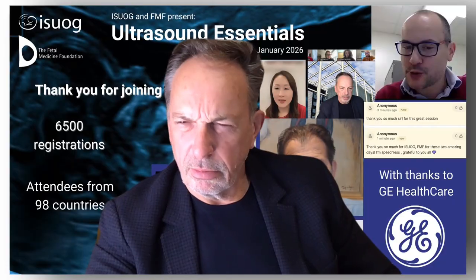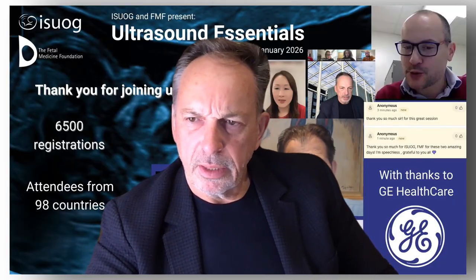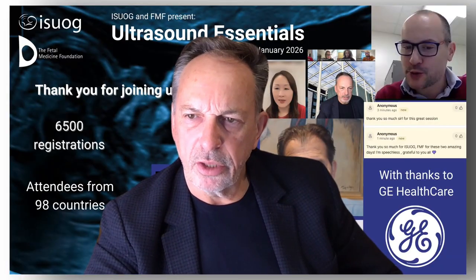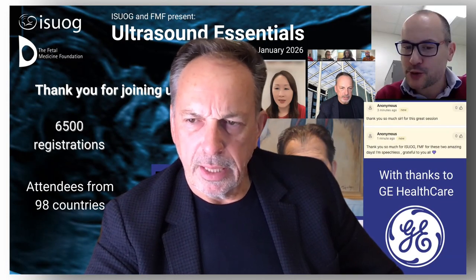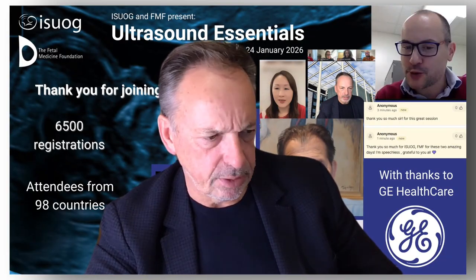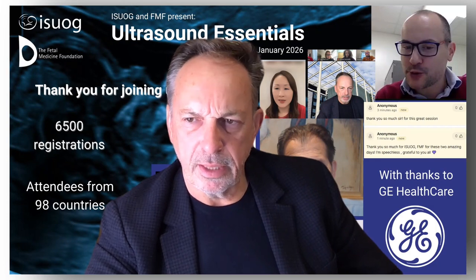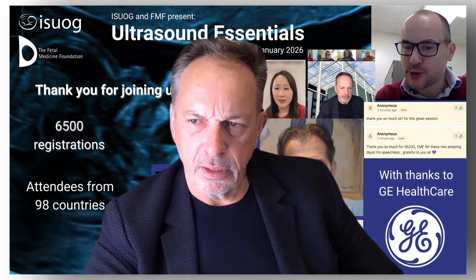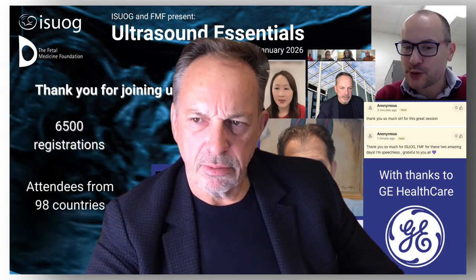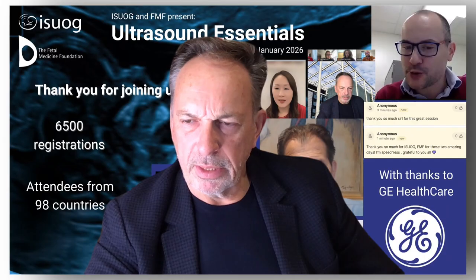I'm not sure I can answer the question per se, but the question is about whether Doppler indices, RI and PI, are useful in suggesting infection. I think in general, indices of impedance aren't helpful because you're going to have low impedance indices in anything where you get angiogenesis and vascularity, really. As a differential, we went through this with cancer and found it was unhelpful.